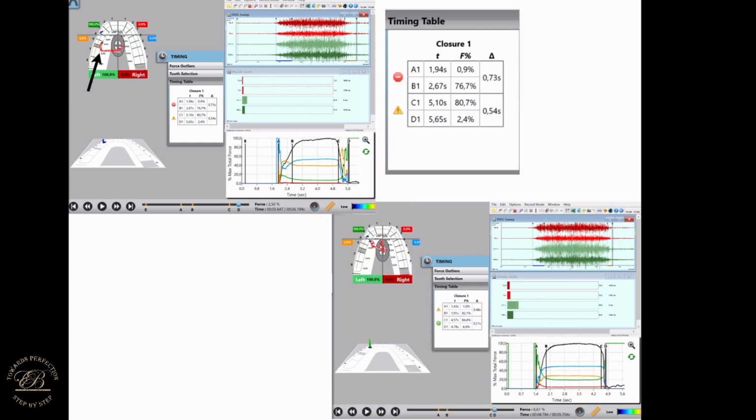That means that there's a conflicting interference at the back of the teeth that we need to have a look at. We can see that the time frame is about half a second, which is somewhat acceptable as long as we go normally under half a second to get to canine guidance. We are happy, but as we can see with this line here, the balance force, I think we can do that a little better. So this is the after treatment.